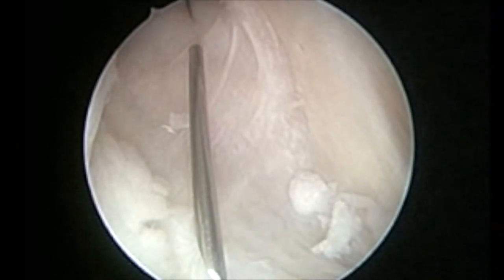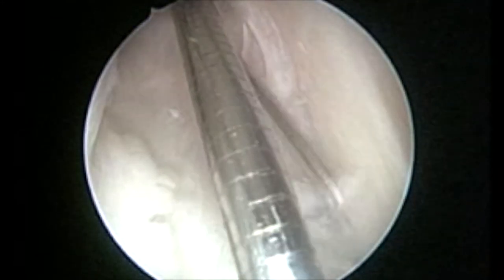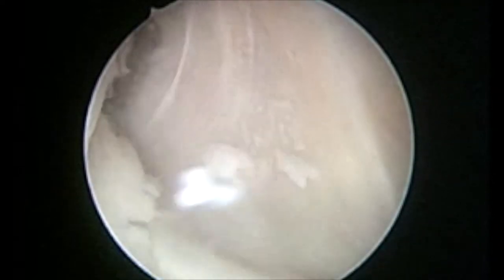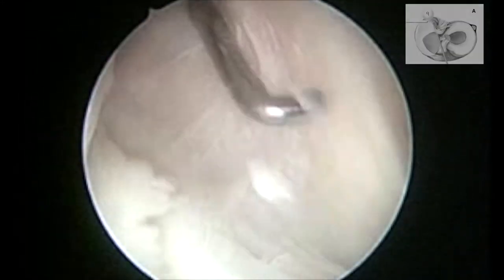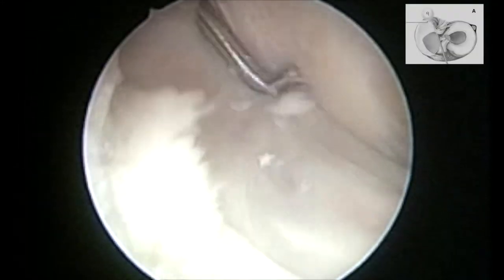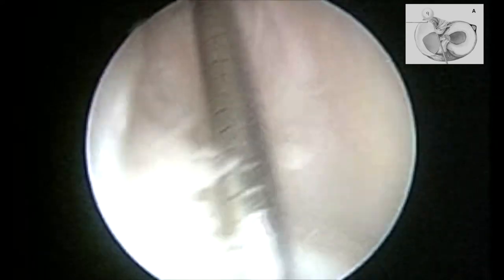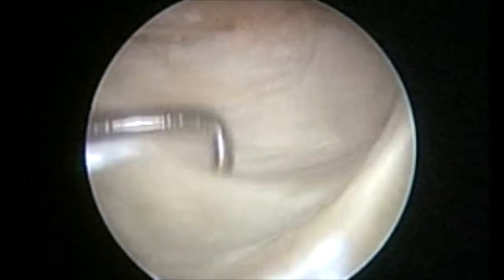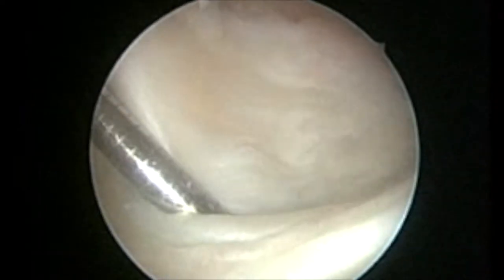The key point in dealing with Baker's cyst decompression is to identify the orifice of Baker's cyst, which is usually covered with synovial folds. With the help of a probe, we can see that posterior and medial to the gastrocnemius folds, there is a transverse capsular fold which covers the orifice of the Baker's cyst. While the orifice is being palpated, one can enter the Baker's cyst through this window.